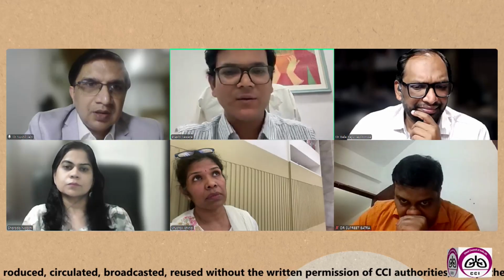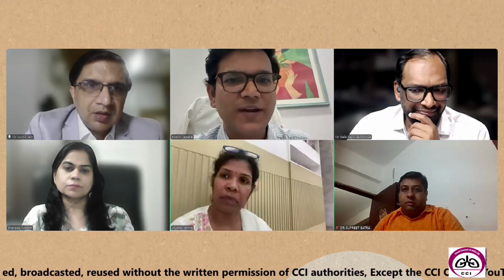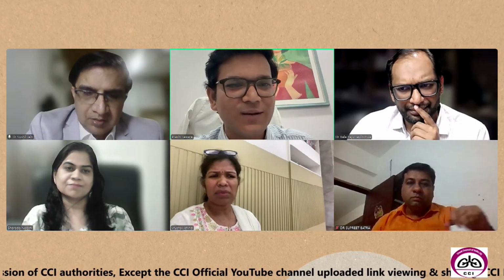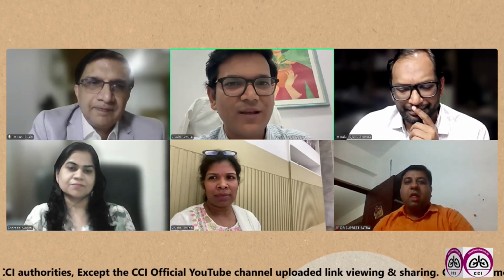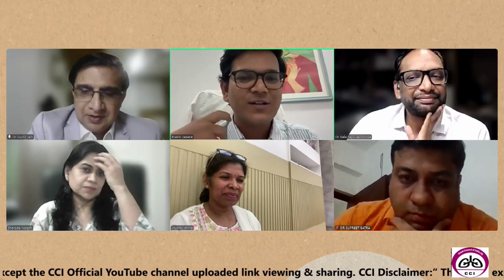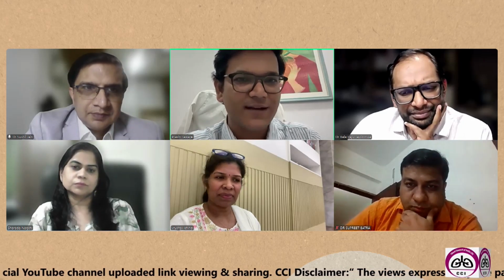So even blood clots are sometimes very helpful, because our pathologist has picked up cells on blood clots. Sometimes we get a non-diagnostic sampling and only the blood clot is picking up the malignant cells. So don't throw away the blood clot. Keep it in formalin or saline, wherever you want to triage, and always push the saline through the needle so that you can make a cell block out of that.